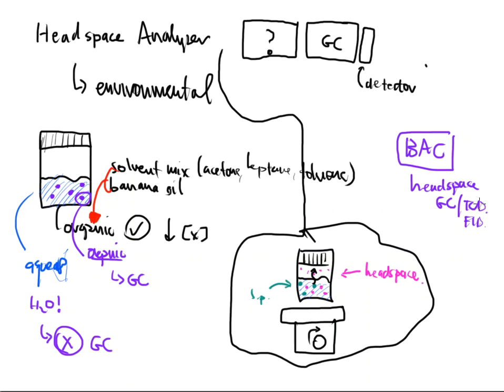And that's exactly what you did here. But you were focused on ethanol. And ethanol has a lower boiling point than water. But you were driving the ethanol up and out of those samples, and that ethanol was getting delivered to the GC system, and then that's where it was getting picked up and measured. The same way what happened to the blood sample.